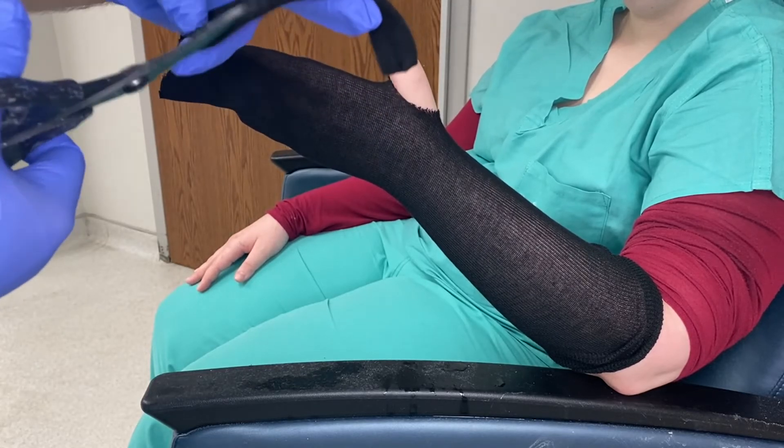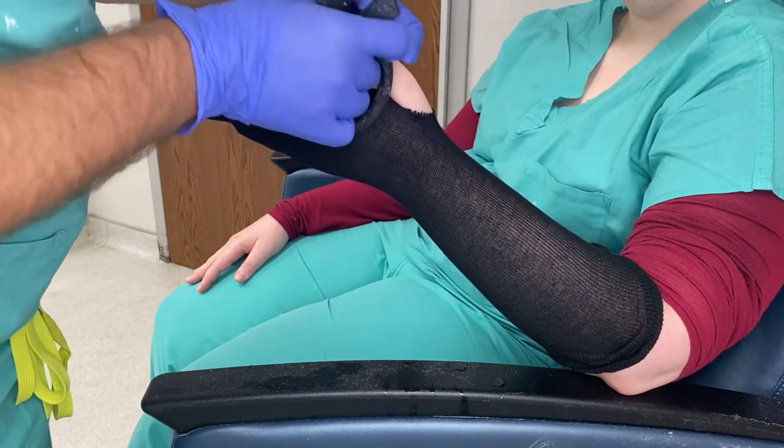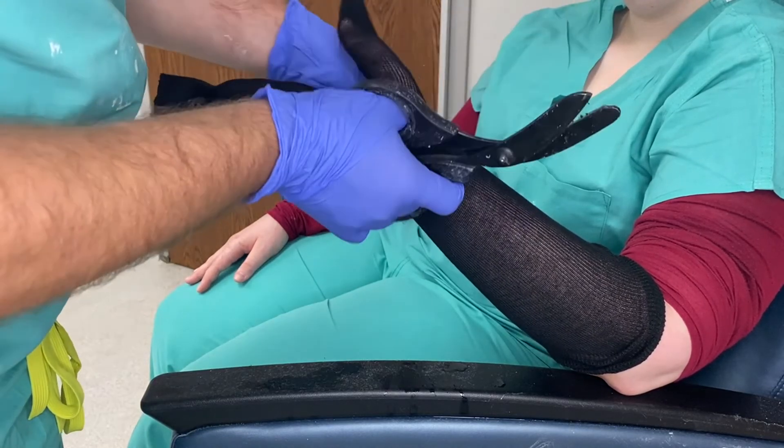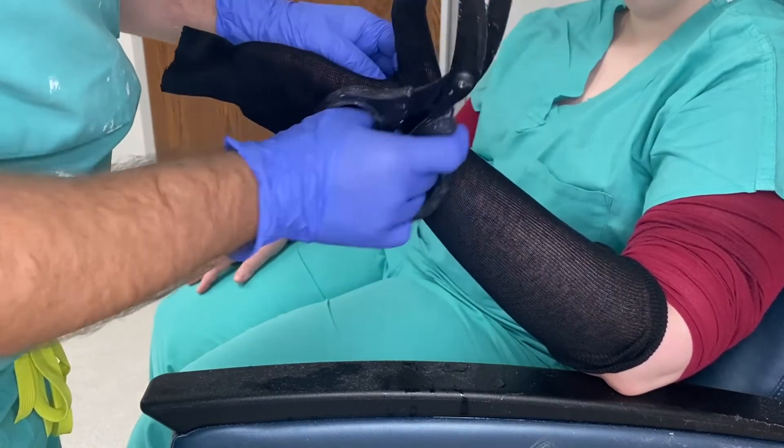Then take some 1 inch stockinette and cover the thumb.